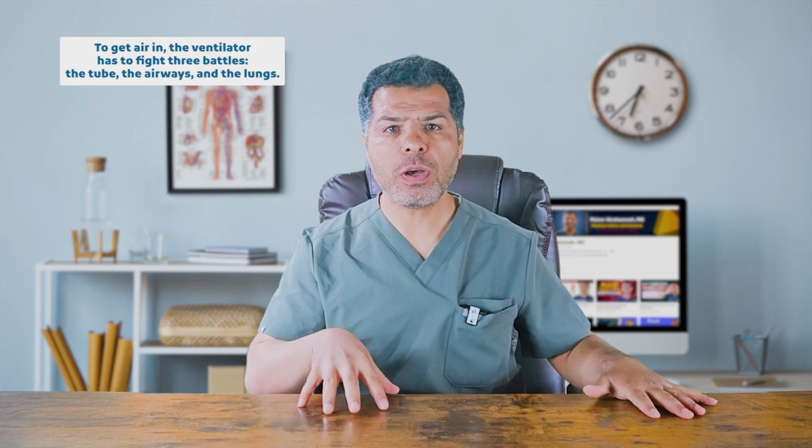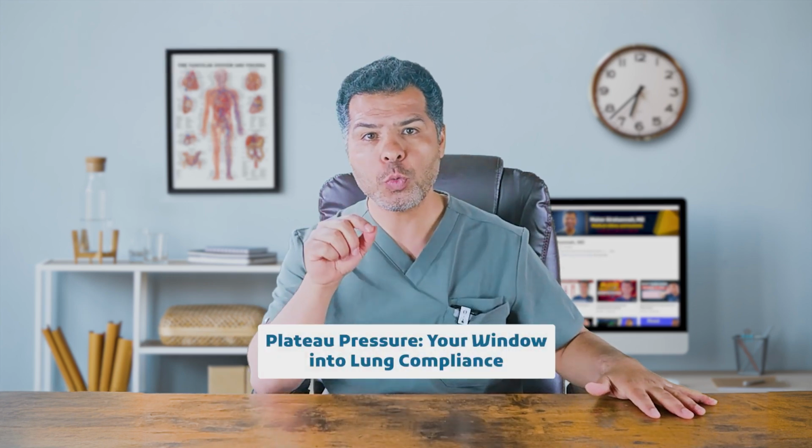Let's move to the fifth concept. Plateau pressure is your window into lung compliance. Let's imagine a moment when the flow drops to zero. This occurs briefly at the end of inspiration just before expiration begins, and again at the end of expiration just before the next inspiration starts. These are the transition points between phases of the respiratory cycle when there is no airflow, because the pressures in the airways and alveoli are equal, no pressure gradient.